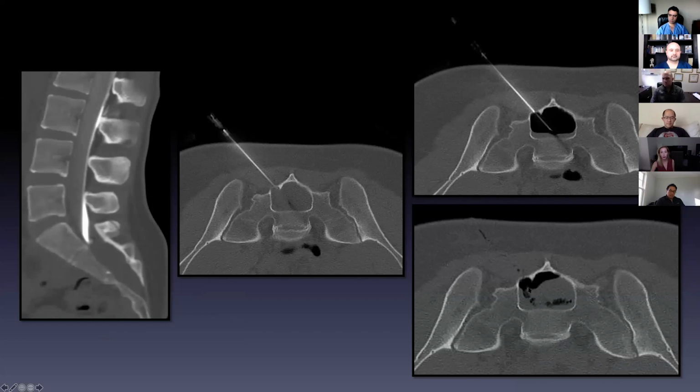fibrin glue, which will be reabsorbed by the body, but first, hopefully that inflammatory reaction will close up that little hole. And indeed for this patient, she was better within a couple days. I checked on her actually 2 years later, still doing great, never had another problem. I get maybe one of these a year, and I've been fortunate that every single one of them has been helped by this. So good procedure.